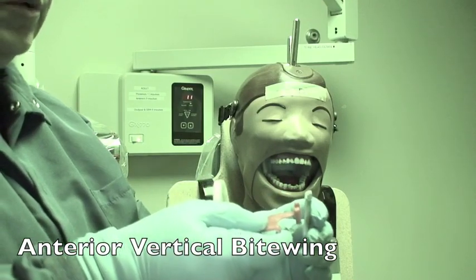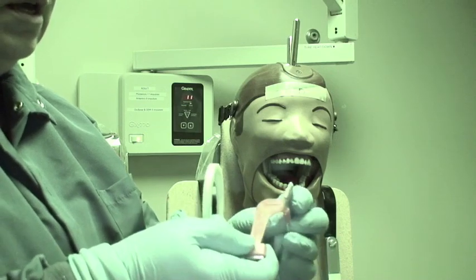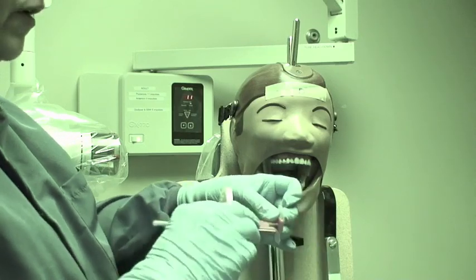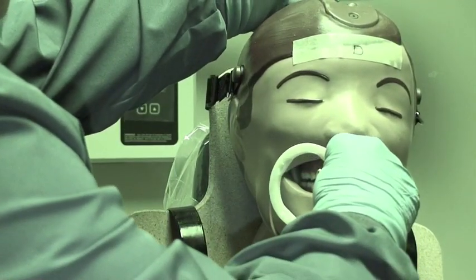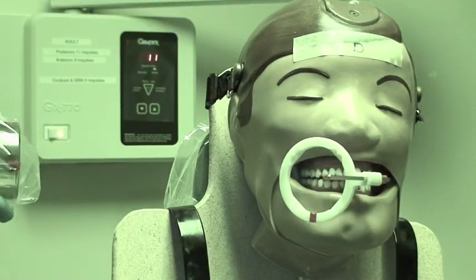When doing the anterior, starting with the canine view, use the vertical anterior holder and place your film the same way. For this one we could use number two or number one film, but we're going to use number one because of the mannequin. Center the canine on the bottom arch, then line up the PID parallel to the ring.